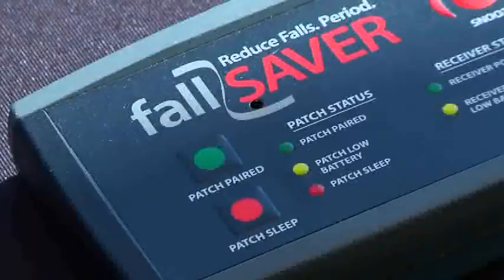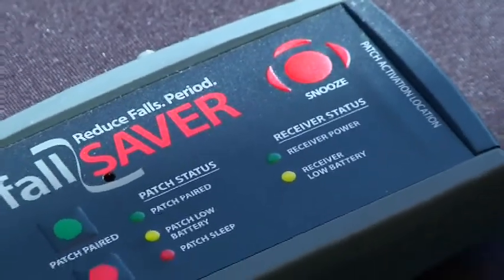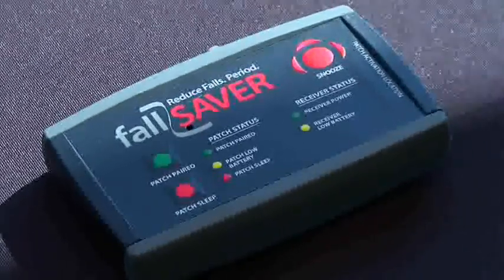Okay. So if I'm a person in the hospital sitting down, and I stand up, this device actually detects that I stand up. Right. It wirelessly transmits to a base station that could be at the nurse's call center, and it identifies that this person is standing up that shouldn't have been standing up. So it's really a very simple, elegant solution to some of the falls that are occurring in hospitals that cost insurance companies literally billions of dollars a year.